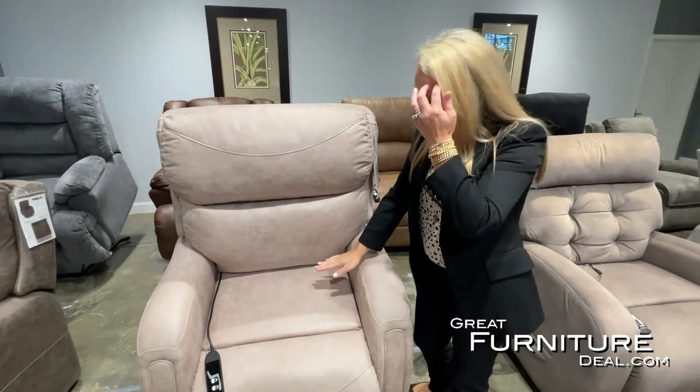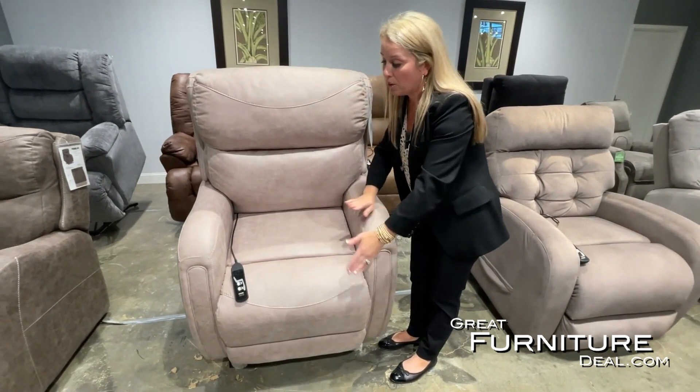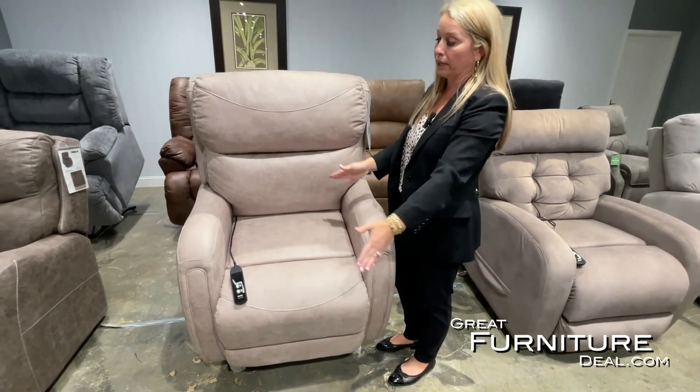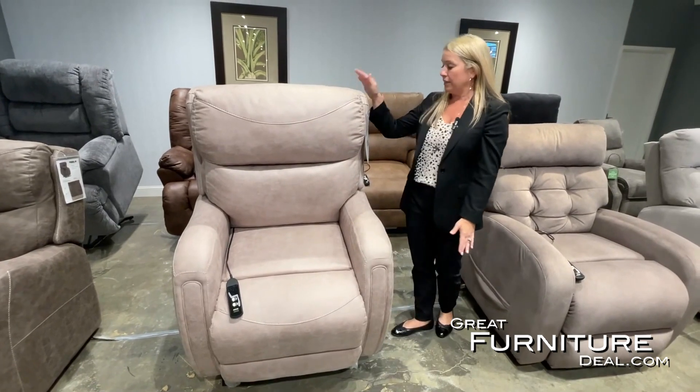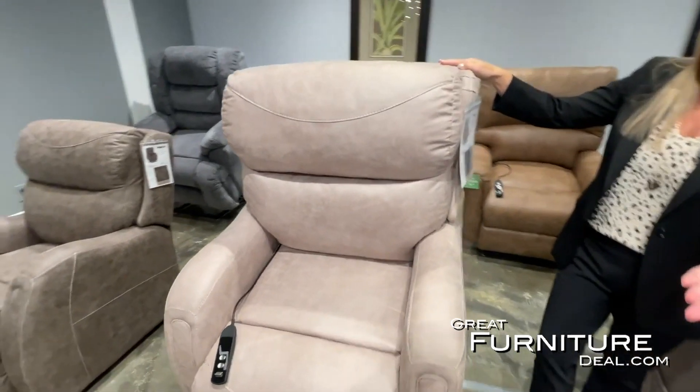This particular chair is what we call a three-way chaise lift chair. That is going to be one cushion that is complete from the seat all the way to the feet, so there's no break in that cushion. You can see the chair is in the upright lift position, easily helping someone get out of the chair.